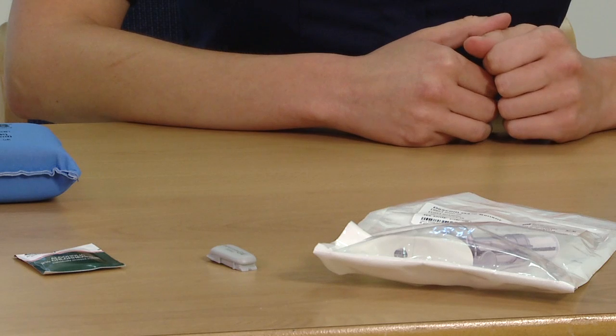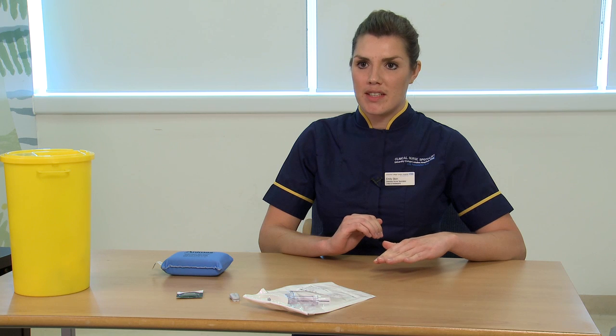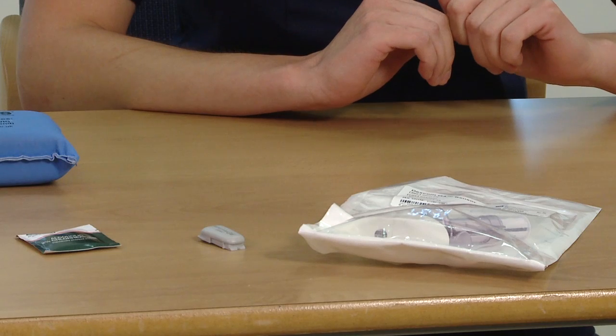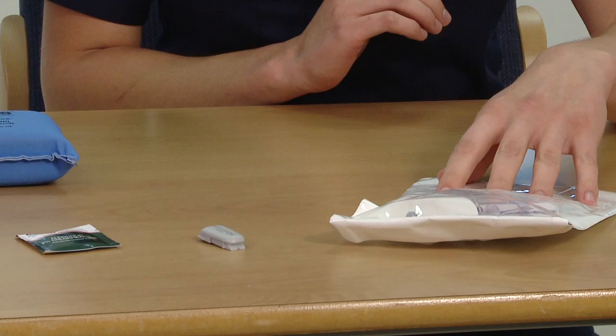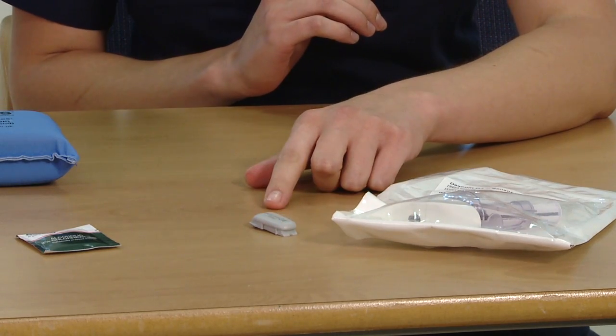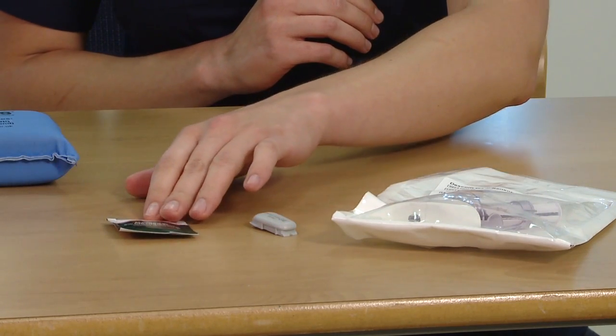I'm going to demonstrate how to insert a Dexcom sensor. First, I'm going to make sure that my hands are clean, so I'm going to wash those, and that the area I'm preparing the sensor on is also clean. The equipment I need is my sensor applicator, my Dexcom transmitter, and an alcohol wipe.